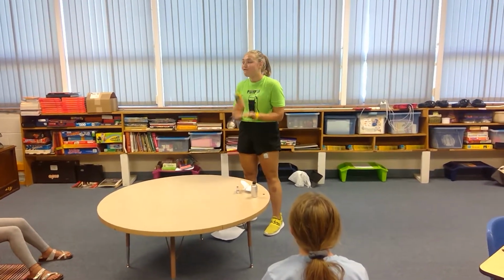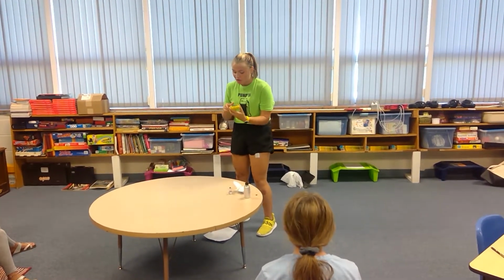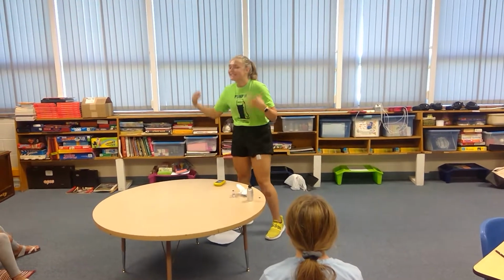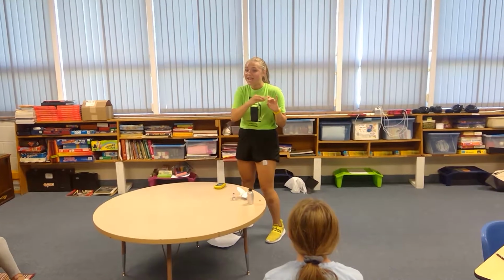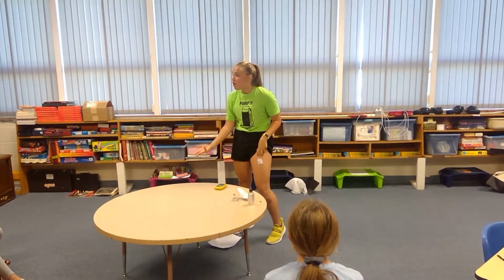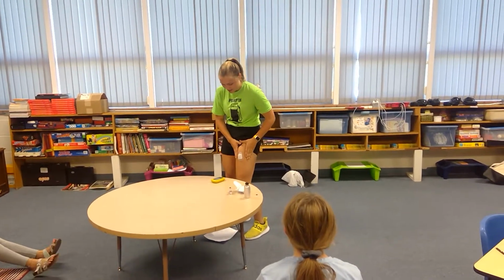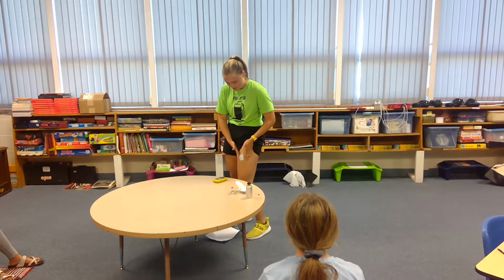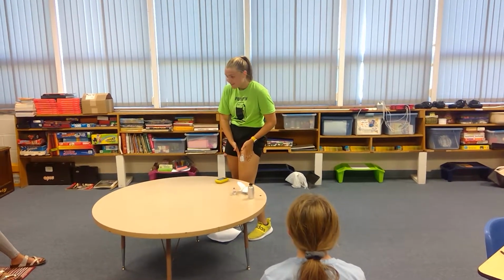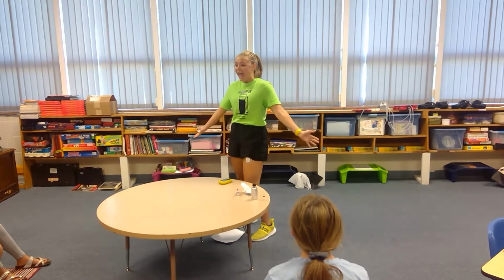And now this is my favorite part about the pod. All we have to do to make sure the needle goes in and the cannula is push a button. So when I hit start, what's going to happen is it's going to put in a little needle and then it's going to put on a tube over it called a cannula and retract the needle. So then over the few days, it doesn't hurt as bad. And then you can hear about 7 clicks, it's going to go in. So 1, 2. Do you hear that? And we're done!